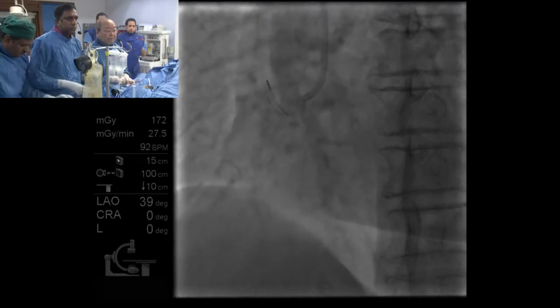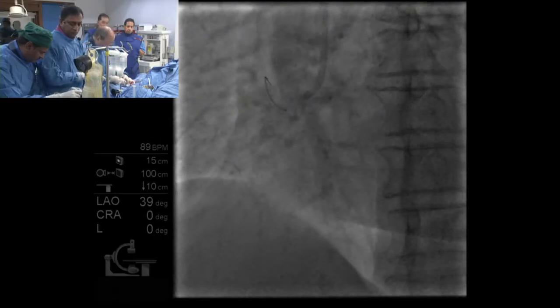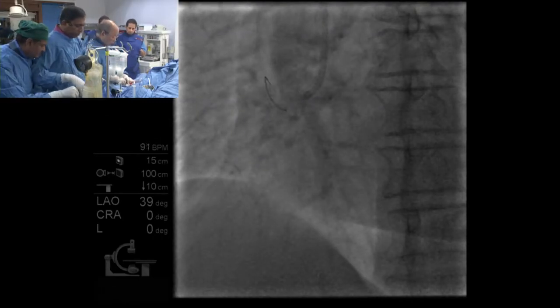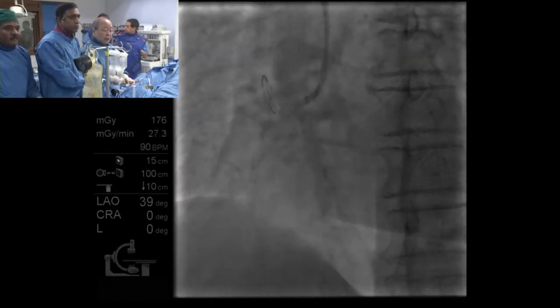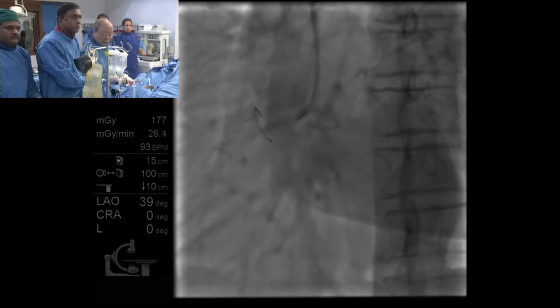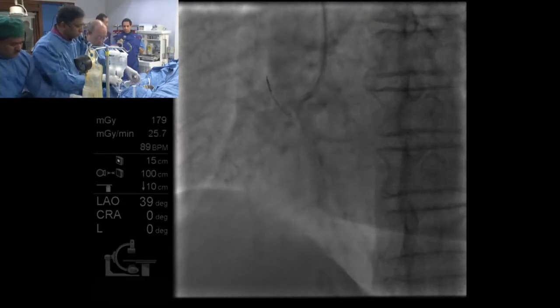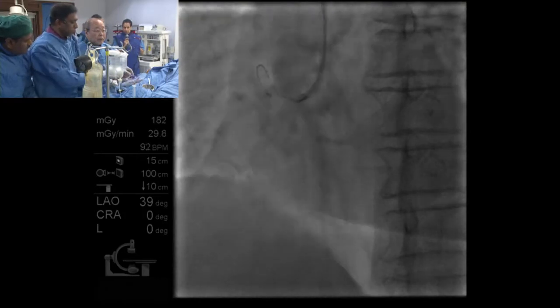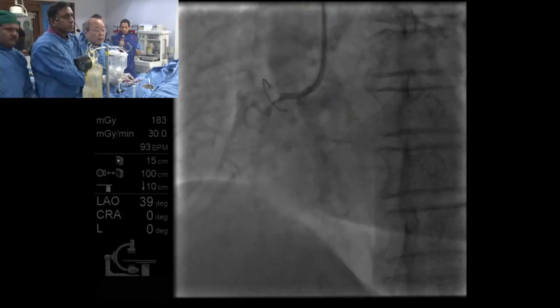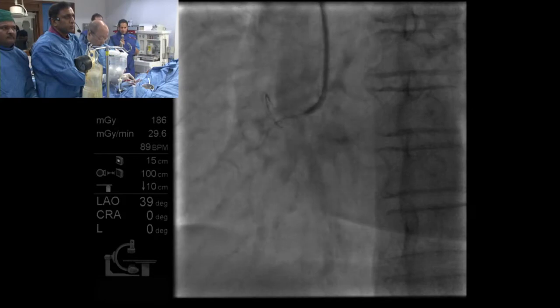Dr. Saito, how often are you using retrograde nowadays in Japan? Maybe if we can see some acceptable retrograde route, we usually start from retrograde. So the first approach is retrograde when you see good collateral. Yeah. How about you, Rajiv? No, I think we typically favor more of a US approach, which is to be ready for everything and choose the best strategy that works in an algorithmic manner. We've learned that from Aaron Grantham and his papers and experience. We would typically do that, recognizing that there are different ways of doing this.